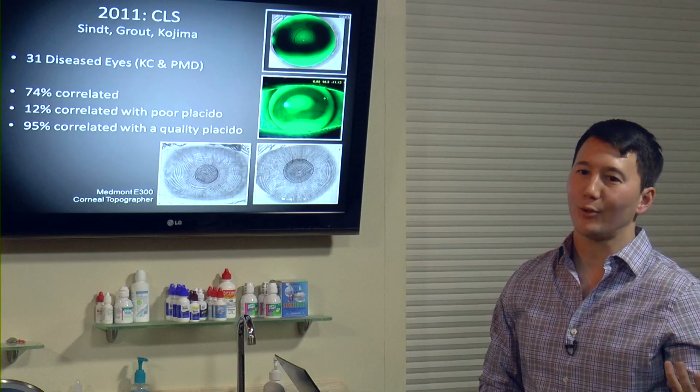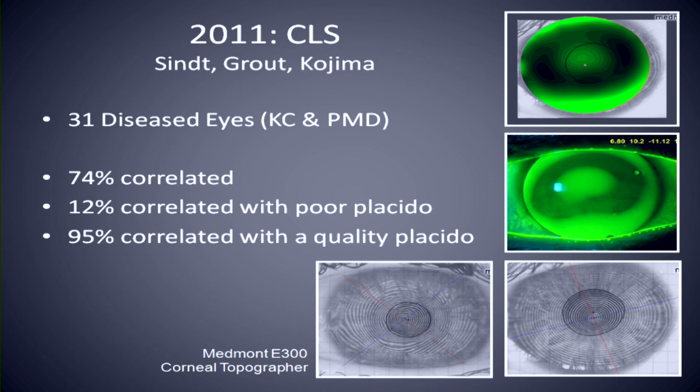Can we actually take a corneal topography and fit a keratoconic patient with this and expect the theoretical pattern and the actual to agree? To understand whether that was possible at the University of Iowa with Christine Sint and her colleagues there, over a 1-week period, we took every keratoconic patient that came through the door and pellucid patients. So all the keratoconics, all the pellucids, and we mapped them, and then we designed up a theoretical lens and tested the actual lens.